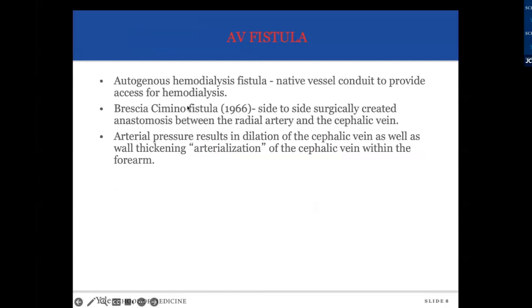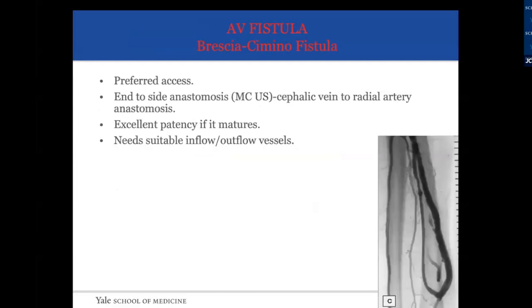So the radiocephalic fistula will be the ideal fistula, which is the one that is created around the wrist. And that is one of the only ones that has a particular name. It's one of the fistulas that actually lasts for a longer period of time.